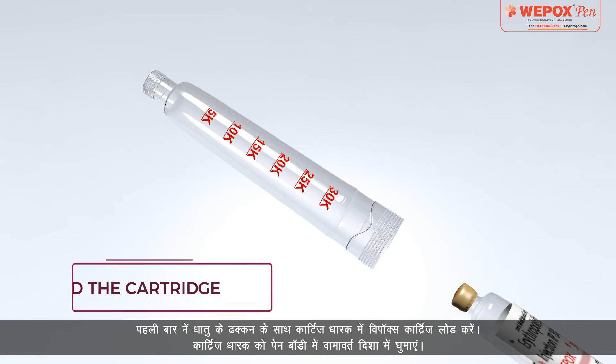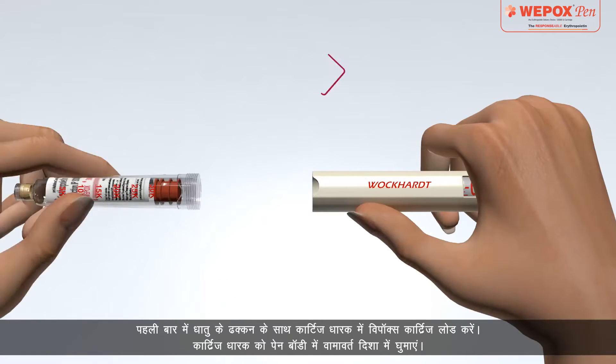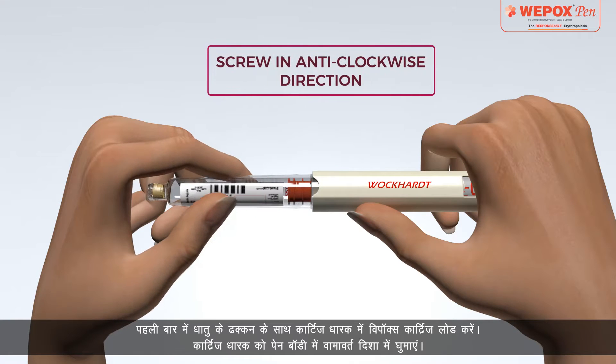Load Wipox Cartridge into the cartridge holder with the metal cap in first. Then screw the cartridge holder into the pen body.